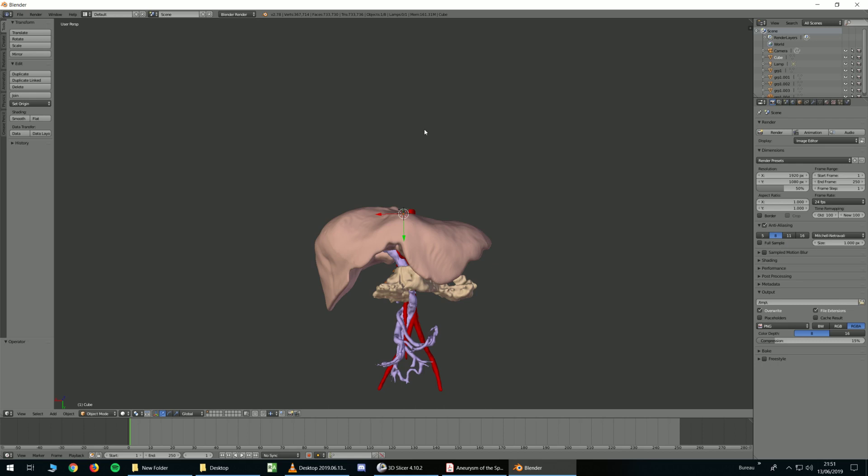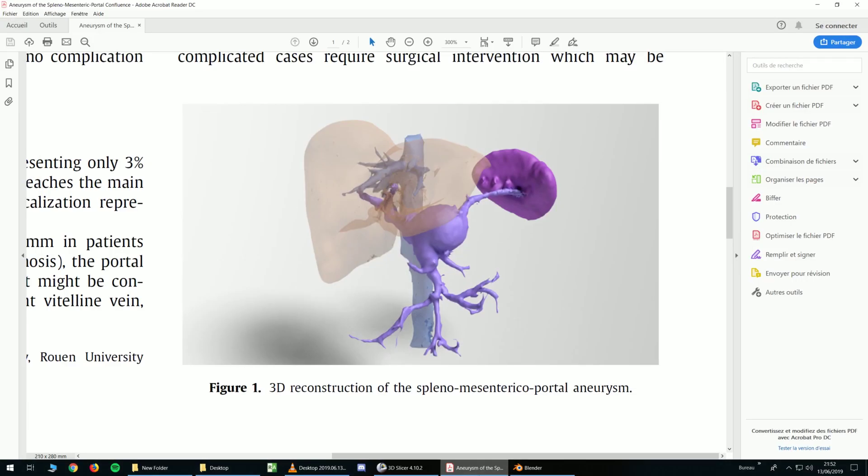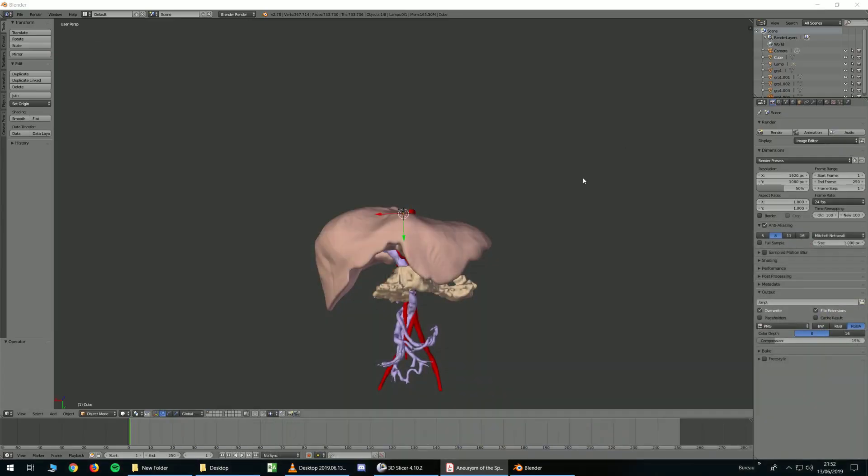It can be useful, for example, if you want to publish some articles and you want to have nice reconstructions in your article. For example, we did this one. I used 3D Slicer for making the 3D models and Blender to make light effects and things like this. Maybe you can use it for presentations or anything you want. You can have better images if you use a little bit of Blender. But it's not an obligation and you can make nice things just with 3D Slicer.